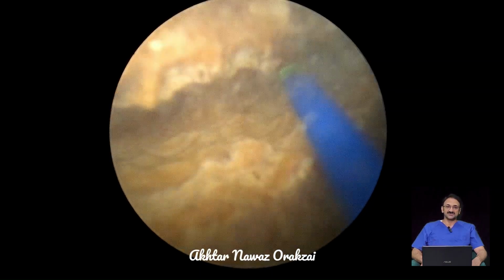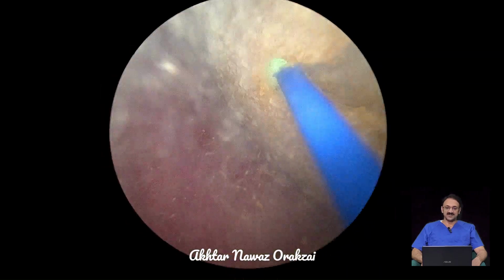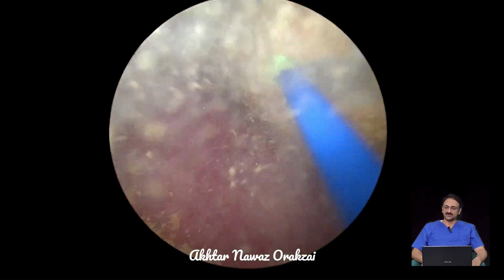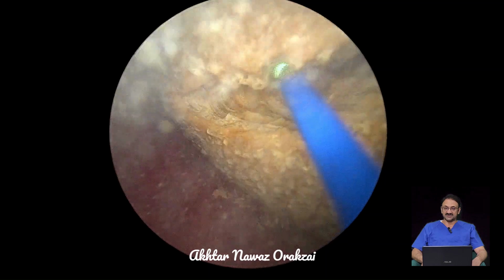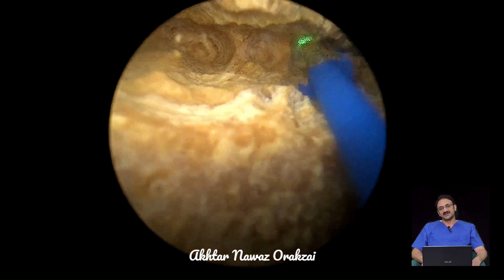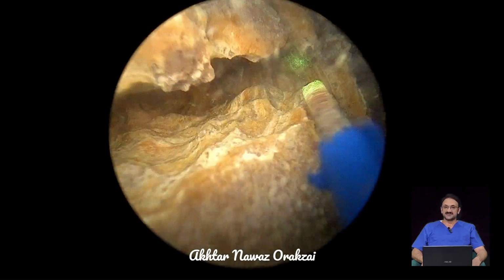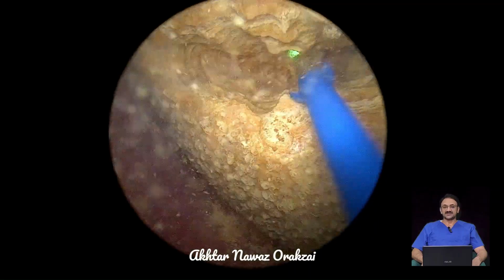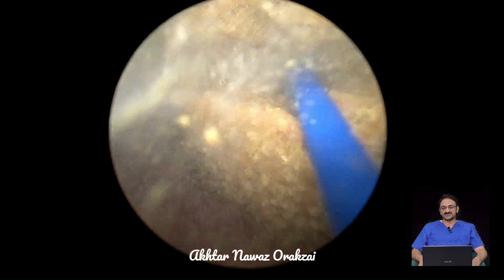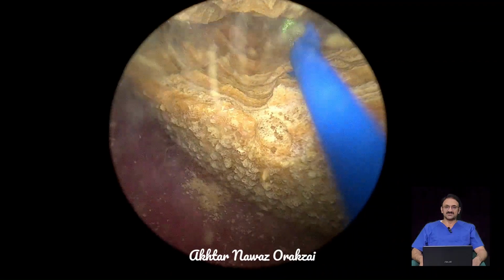Completely converting the stone into sand by laser fiber will take a long time. So I think this was one good way to avoid vesicolithotomy, to avoid percutaneous cystolithotomy, and also not take a very long time. Even this fragmentation with the laser took us around 45 to 50 minutes. And then the rest of the procedure with the stone punch, which means litholapexy, took around 10 minutes.